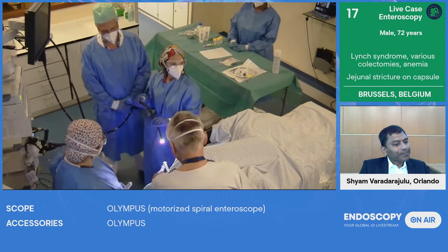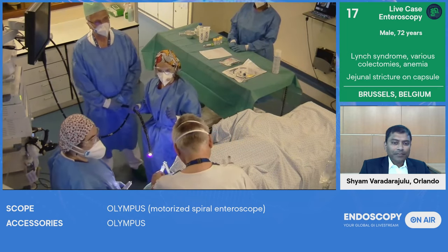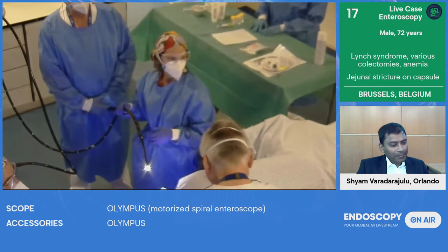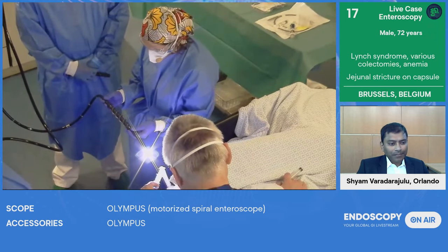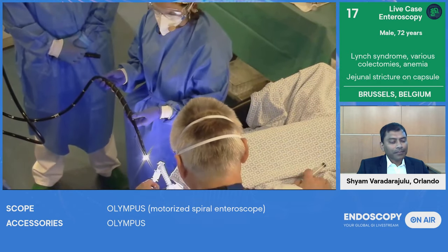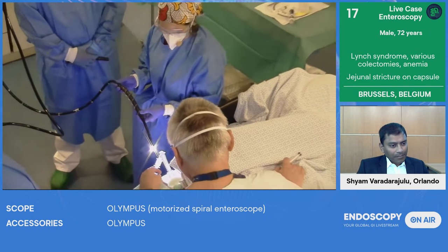So we have already done an upper GI endoscopy. We still dilate with a 20 millimeter bougie before doing the spiral. Our friends from Düsseldorf said that it's not necessary, but there's still no comparative on that, of course. But it still gives us a general feeling about how the spiral is going to pass, and also an overview of the upper GI. So there was no particularity.